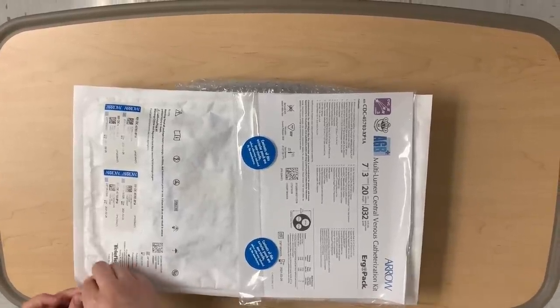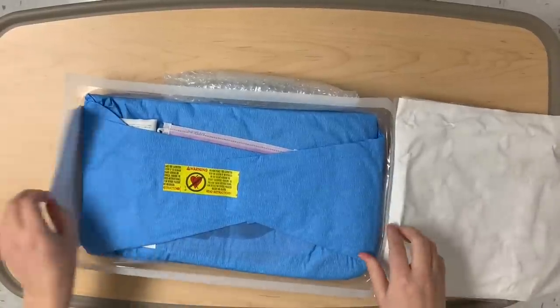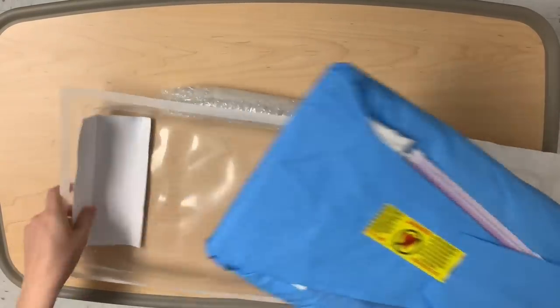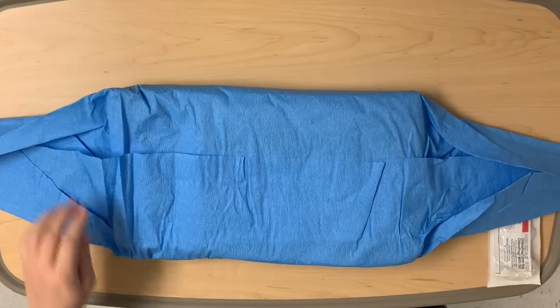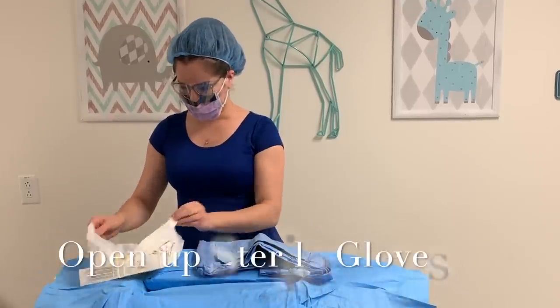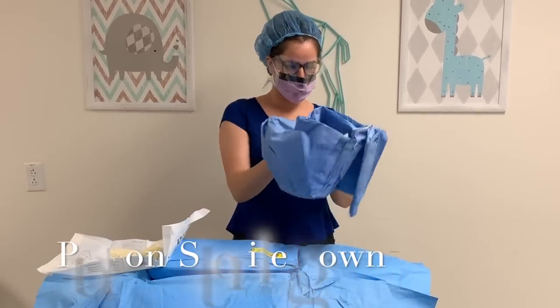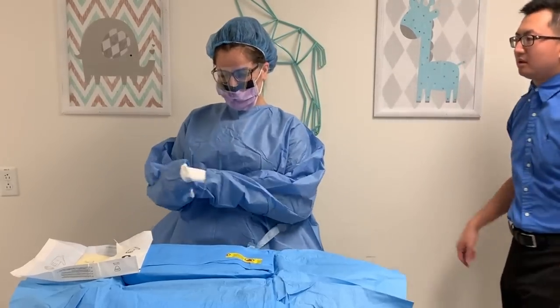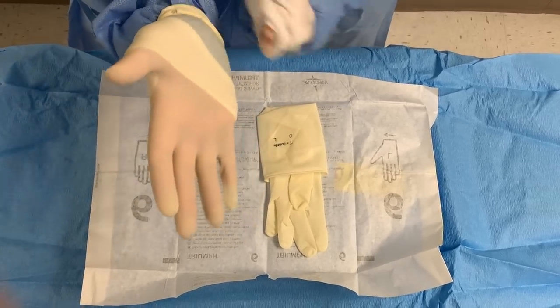You see how there's a little tip on this side? It makes it easy. So you open it up, just like this. Then what we do is we take this out.